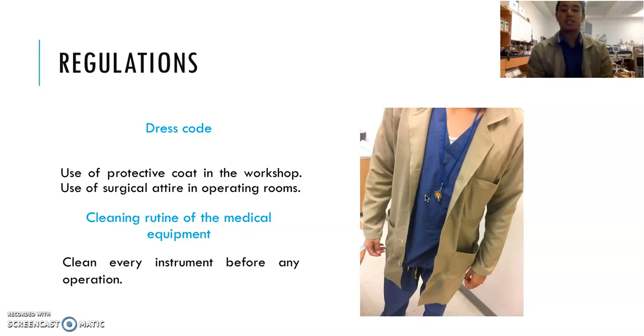And also sometimes you need surgical attire in the operating room, because if some device is failing in that area, it is already sterilized. So you need to go to the surgery department, leave your corresponding credential, and then they give you a key from a locker to leave your clothes and use this one, as you can see in the picture right down. And it's very, very important: always carry your credential in case something like that happens.